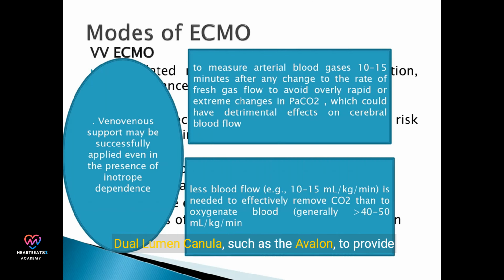Thrombolysis is a process used to dissolve blood clots that may form during ECMO. It is crucial for maintaining the patency of the ECMO circuit. Weaning from VV ECMO involves gradually reducing the ECMO support as the patient's lung function improves. This process requires careful monitoring and assessment.